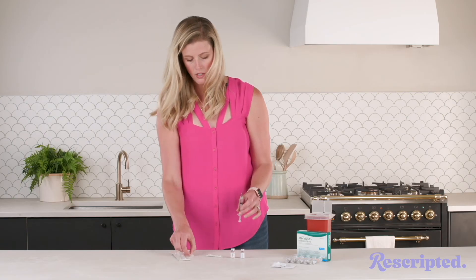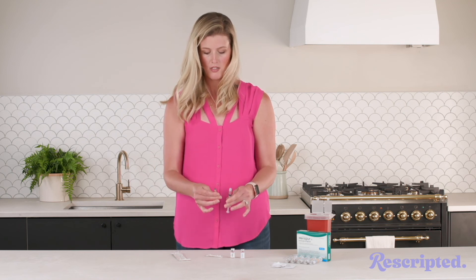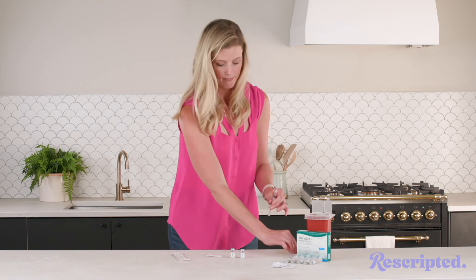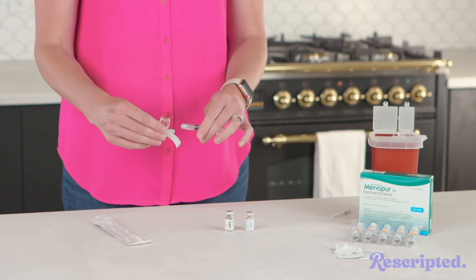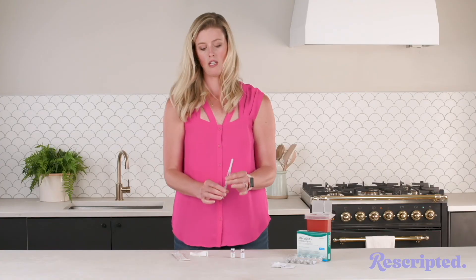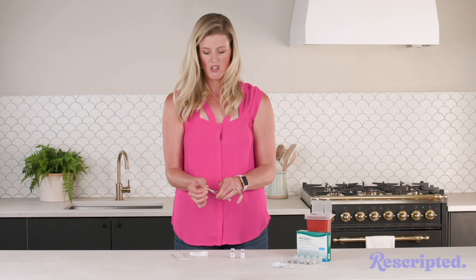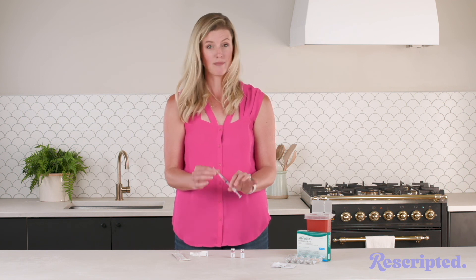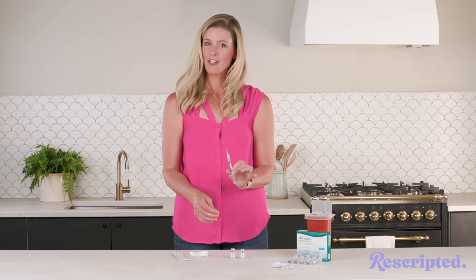Next, go ahead and twist off the mixing needle and set it aside. You're going to switch to your injection needle — twist that one on tight. This needle is a little baby, so don't be scared of it. It is 27 gauge, so as far as needles go, this is probably as easy as it's going to get. Teeny tiny. Now you're ready to do your injection.